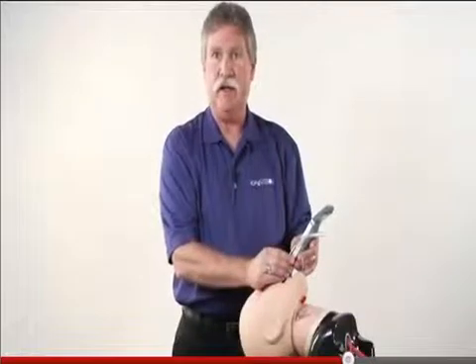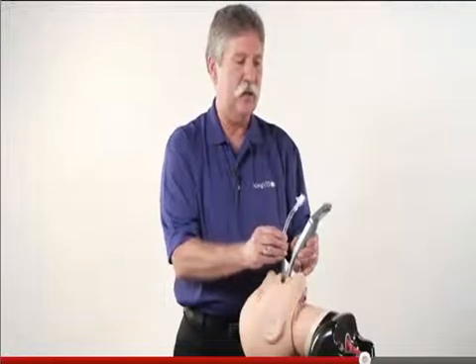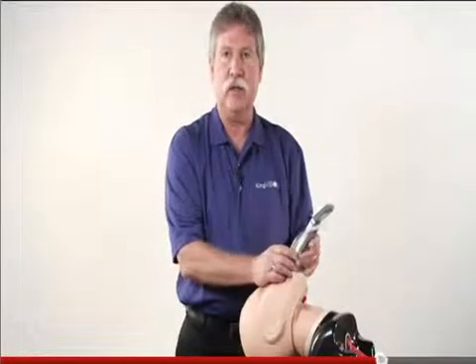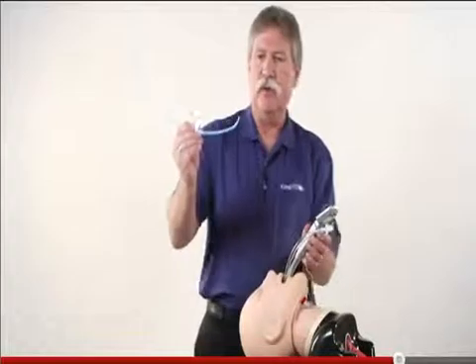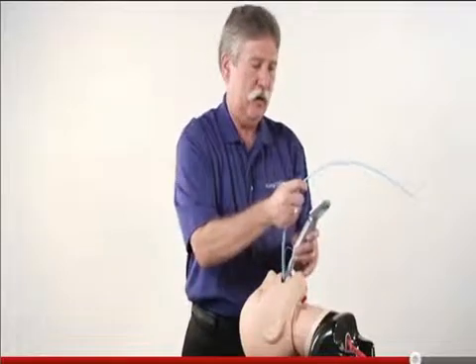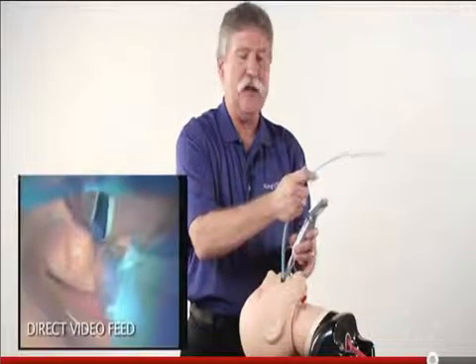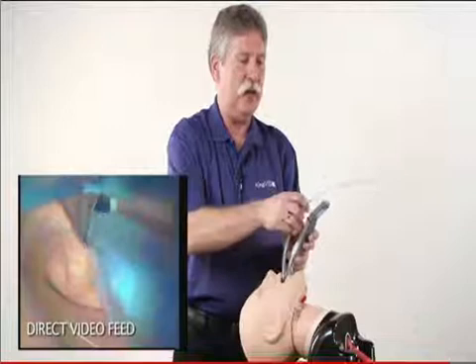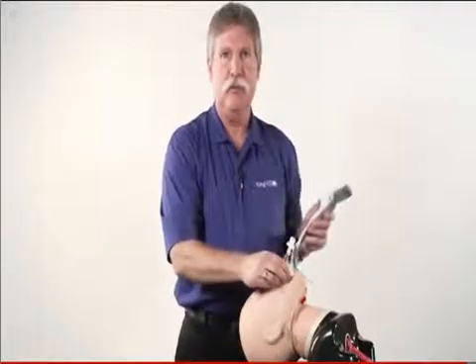For an extremely anterior larynx, we've actually seen another technique that can be used, if you can't, for whatever reason, by lifting and manipulating the tube, get the tube to enter the laryngeal inlet. You just need a little bit more anterior deflection. You can actually use a bougie with the coude tip angled anteriorly within the tube, positioning the tube right under the opening to the larynx, using that angulated tip to advance the bougie through the vocal cords into the trachea, then advancing the tube, again watching it to make sure it goes in the trachea, withdrawing the bougie and removing the blade in the normal manner.